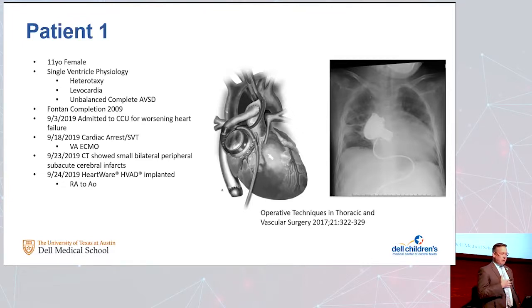A lot of hemorrhaging in there already. She'd been on ECMO for 7 days. Also, all these patients are 3, 4, 5 time redo sternotomies, so the scar level, the adhesion level within this chest was immense and everything was bleeding. So to dig out the ventricle to implant this in a normal fashion was really not an option. So that was one problem.